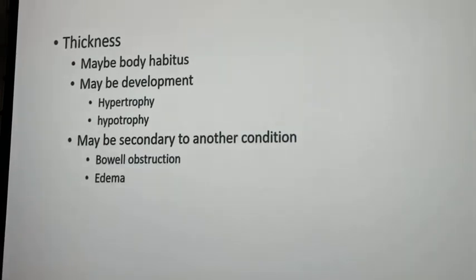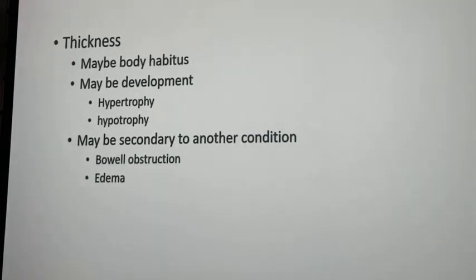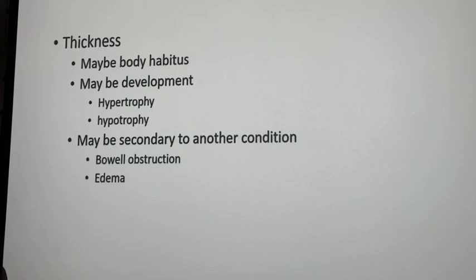So that's also a buildup of fluid, right? Well, no. In a lot of cases, or in most cases, what you have with a bowel obstruction and how you diagnose a bowel obstruction is abundance of air. So the air is not even passing. So on an upright abdomen or chest x-ray or decubitus abdomen, your telltale sign that the patient has a bowel obstruction is air fluid levels.